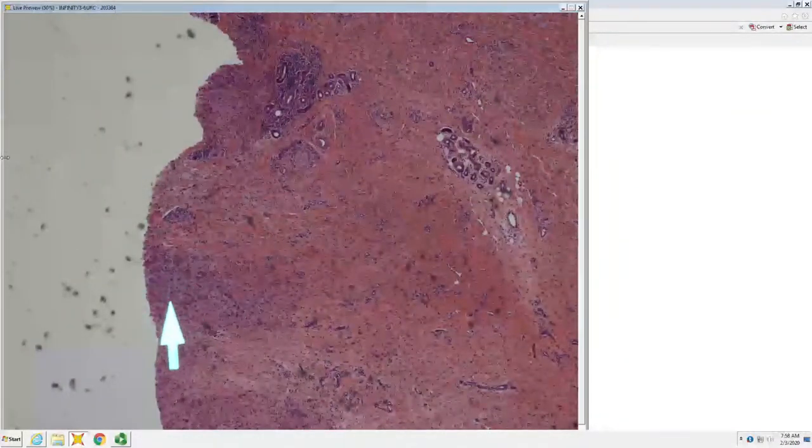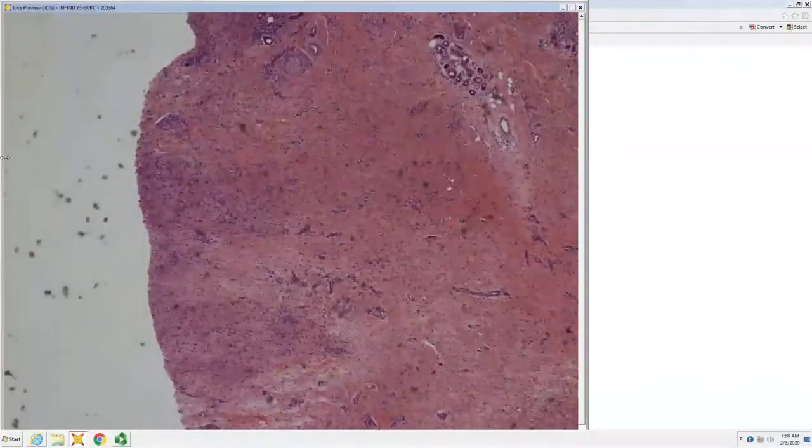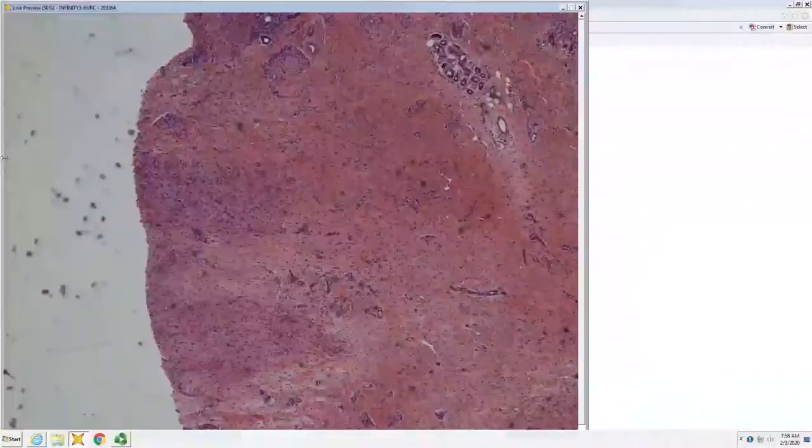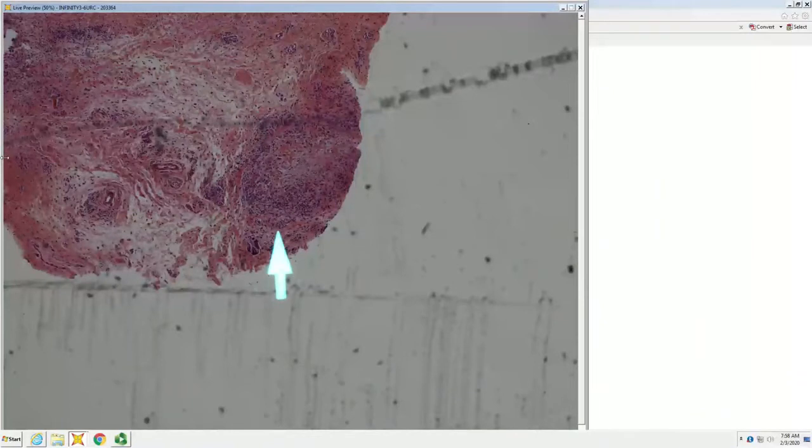Busy dermis, and then you have, what's that gray stuff? Mucin. And is it uniform, top to bottom, side to side, or is it patchy? It's patchy. So what would be patchy with mucin and histiocytes? GA is patchy, whereas NLD is top to bottom, side to side. Right, NLD is top to bottom, side to side. GA is patchy. Okay.